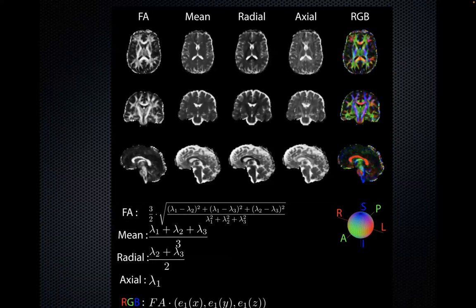And suddenly you see my colors. These beautiful FA colors, these are the colored FA. It's the same feature as FA, where I added a color in the RGB world. So I'm coding the principal eigenvector, E1 here, in the RGB channel.